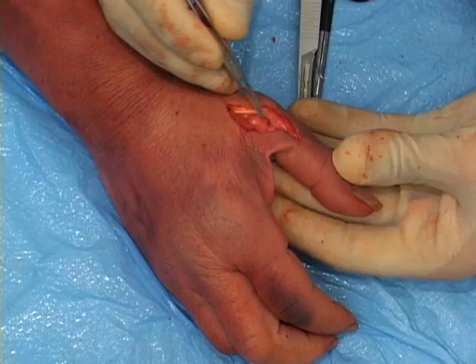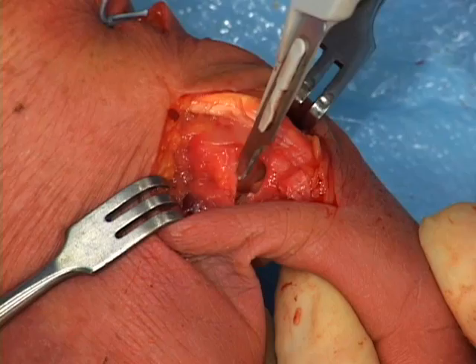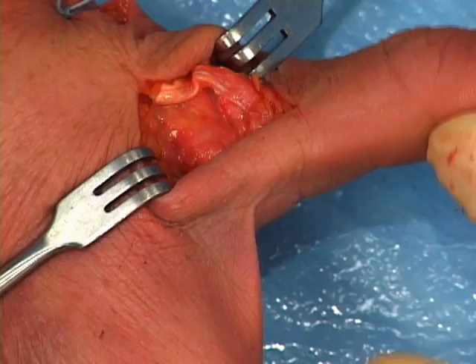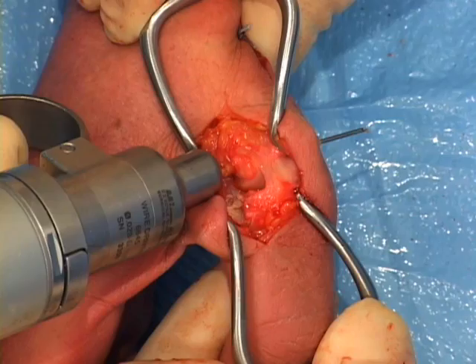The ulnar collateral ligament, or UCL of the thumb, is the main stabilizer of the first metacarpophalangeal or MCP joint. It runs along the ulnar side of the joint between the metacarpal head and the base of the proximal phalanx. This injury most frequently results in an avulsion of the ligament from the base of the proximal phalanx. While acute cases can be repaired, chronic cases or high-demand patients may require reconstruction, as is demonstrated in this video.